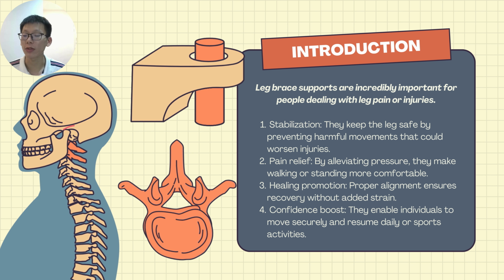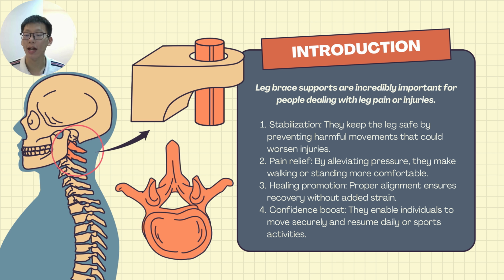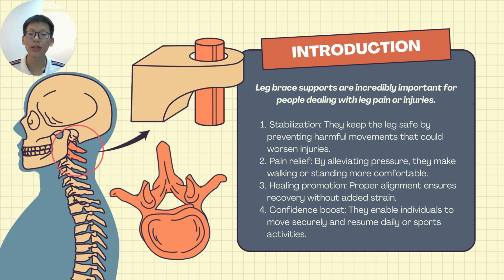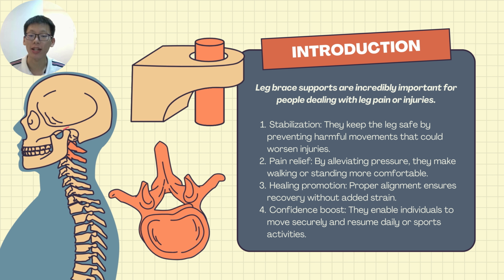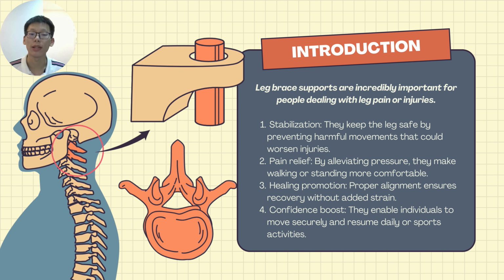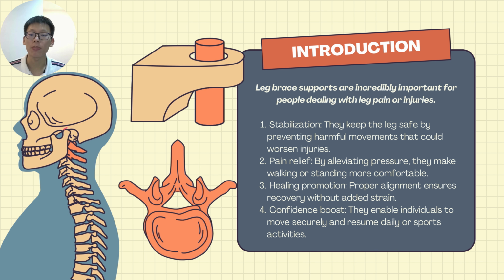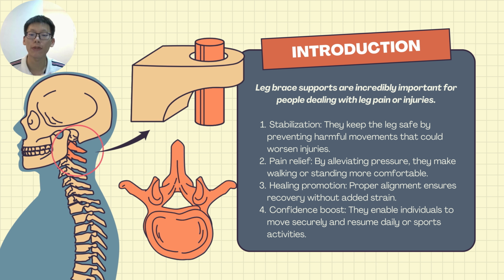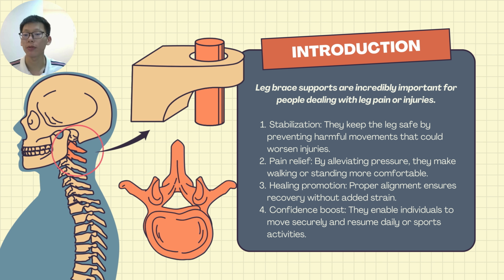So its function is over here. First, it can offer stabilization, and it can also reduce pain for the patients. And third, it also supports healing by keeping the leg properly aligned, so the body can recover without extra strain. So in short, leg brace supports aren't just medical devices. They are tools that make recovery faster, movement easier, and life better for many people.